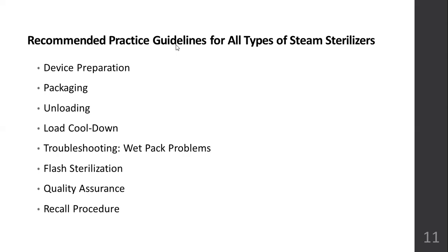Packaging, the way how you pack the items. Packaging will have a lot of labeling required. The proper way of labeling. Which technician is responsible for the labeling? What was the autoclave cycle or sterilization cycle, number of articles, name of all the articles inside this package, name of the kit, expiration date, all these things have to be mentioned in the packaging.